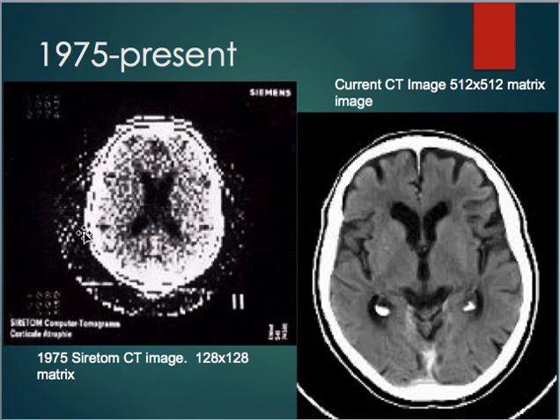You can't really see the clear definition of the skull and the scalp. On this one, look at the white line here, that is the scalp. And then the thicker white here is the skull. And then we've got all the brain tissue here. And you can start to see the ventricles here. Much more detail. But still, this was amazing for its time, and doctors were thrilled to have it.